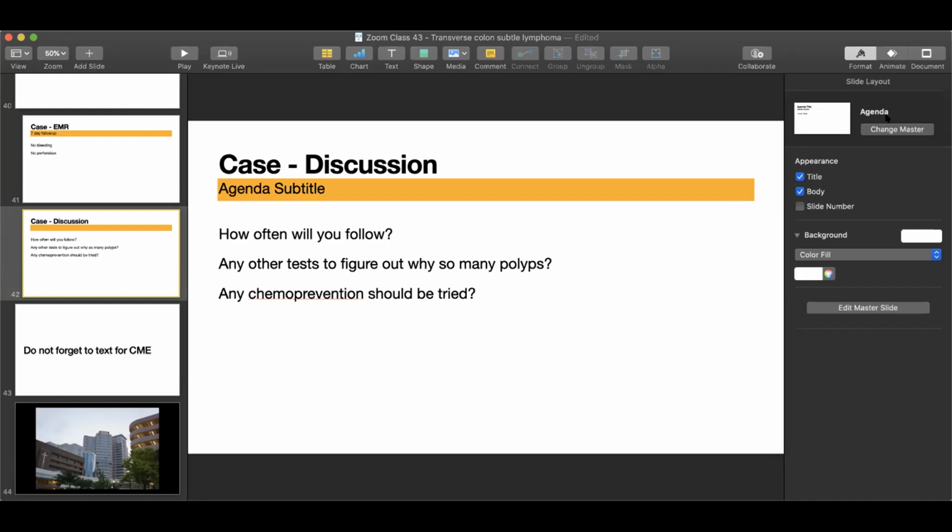So let me ask. We named it the universal colonoscope, and my understanding is that it is the most common type being sold today. I didn't realize that when we bought our own Olympus system, at that time near focus was not available. Did you get these scopes recently, or have they been available for a long time? I want to ask Laura, one of our chief technicians at MD Anderson, to comment on whether we can get those things also.